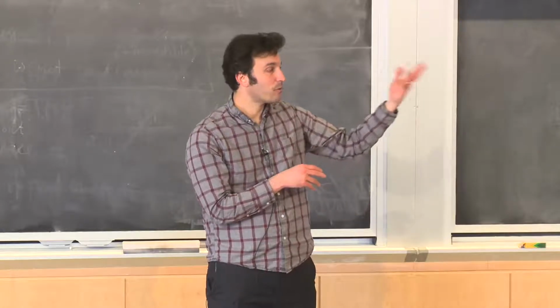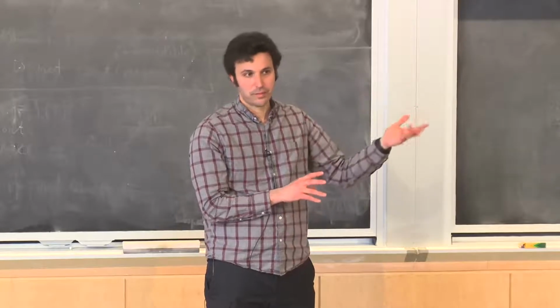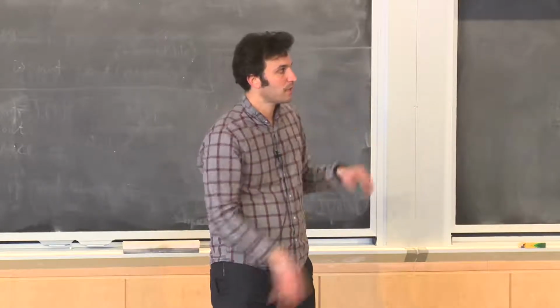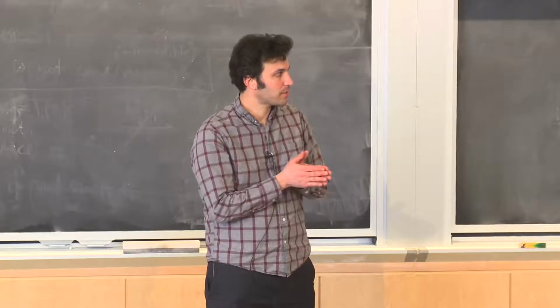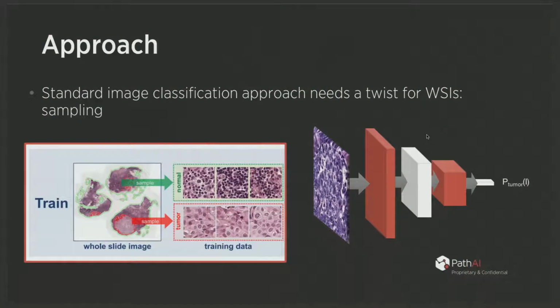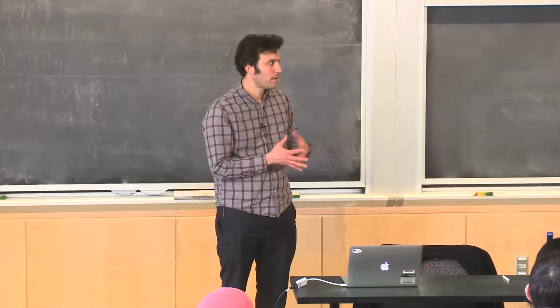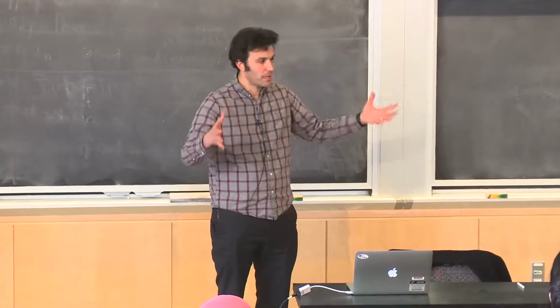You could even provide outputs to humans who can point you to the areas where it's making mistakes, because often you don't have exhaustively labeled data. In this case, we actually did have exhaustively labeled slides, so it was somewhat easier. But you can see there's even a lot of heterogeneity within the different classes. So you might do some clever tricks to figure out what types of the red class it's getting wrong, and how to fix that by providing it with more examples. I think that's one of the easier things to control, rather than trying to tune other parameters within these super complicated networks.